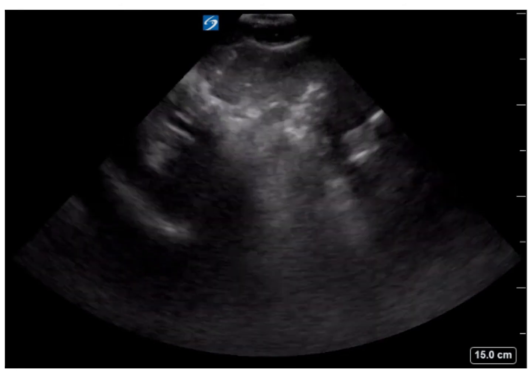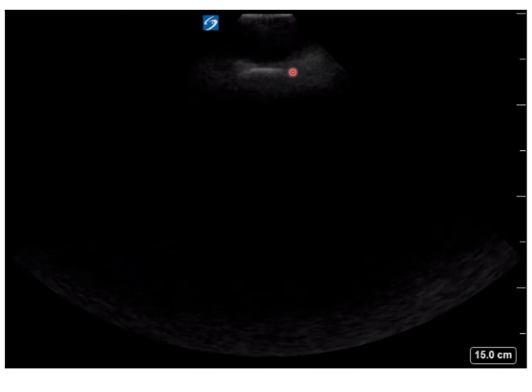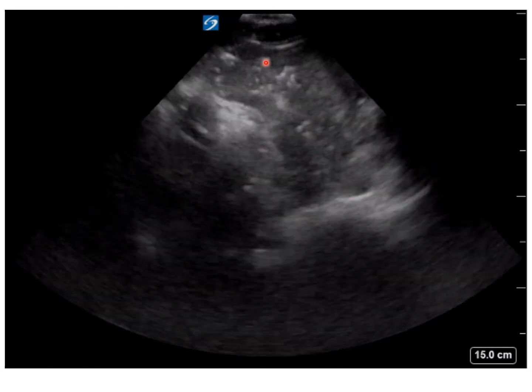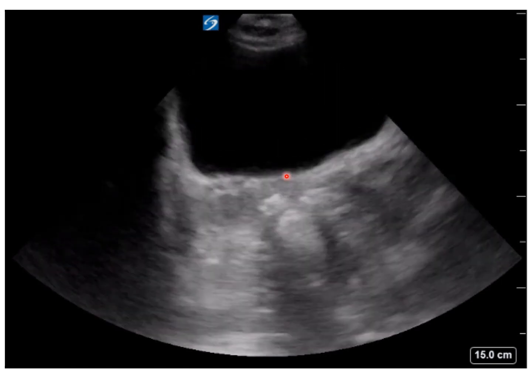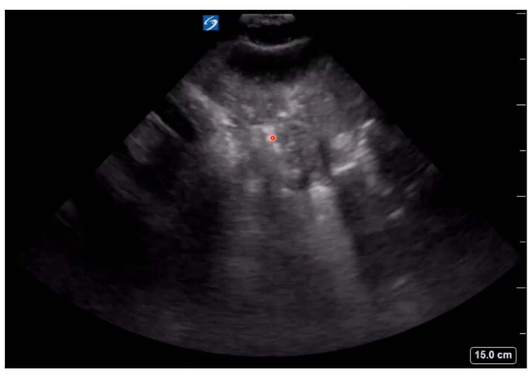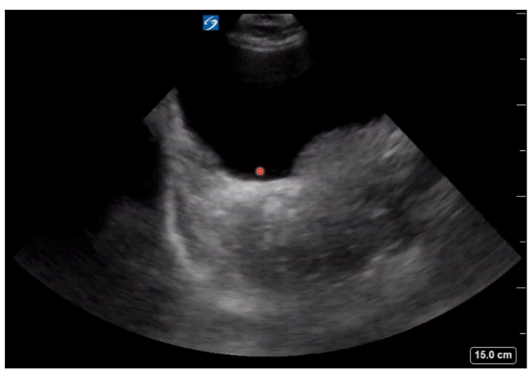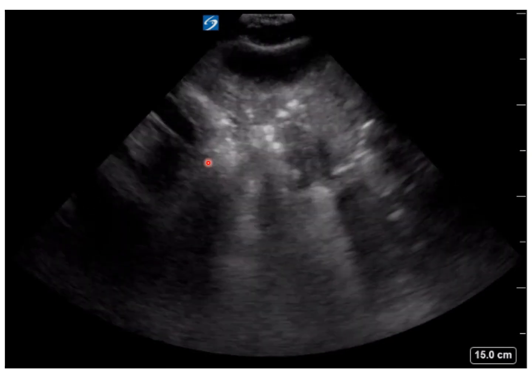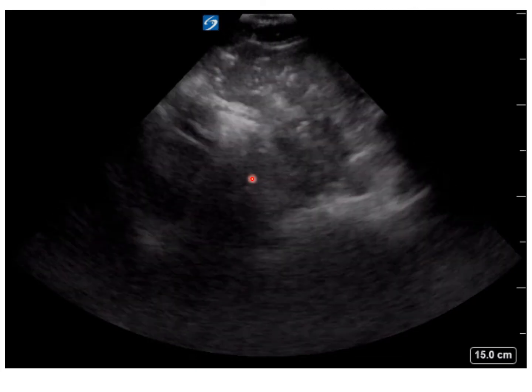And then you turn the probe marker to the patient's right, and you get the transverse view. So now the bladder is near field or closer to the probe, and the uterus is behind it. So here you can see uterus, and off to the patient's right side here, they actually have a small ovarian cyst that comes in and out of view.